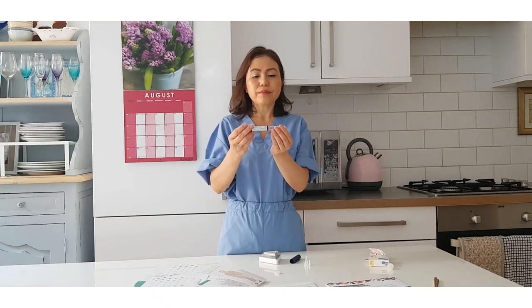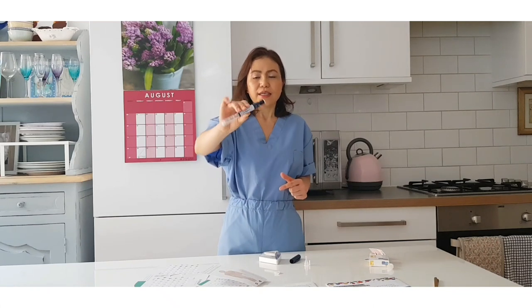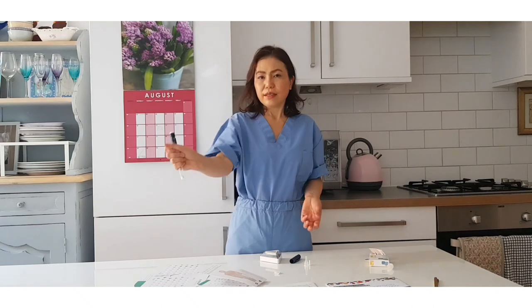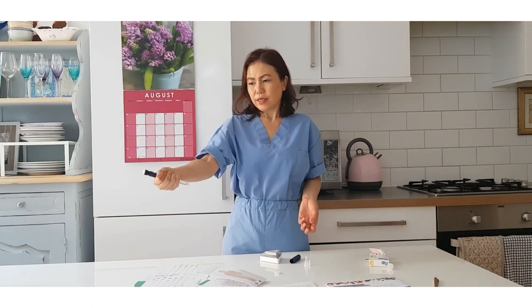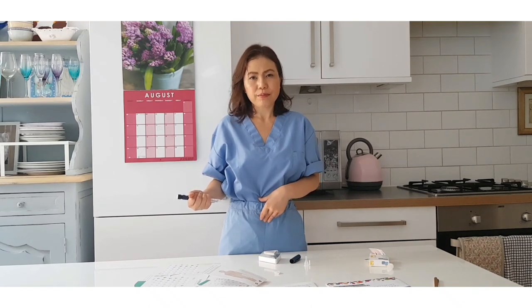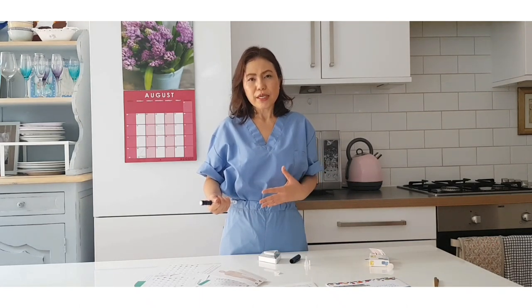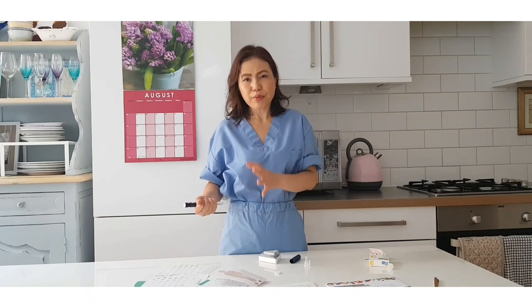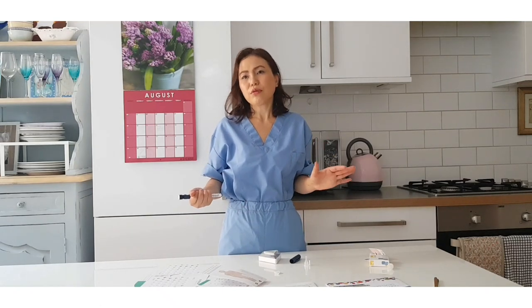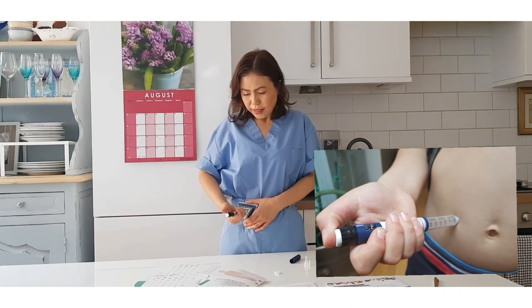If your diabetes practitioner has instructed you to start, say, 10 units, you dial 10 units - about 10 clicks. Then hold the pen at 90 degrees, like you're going to punch somebody - straight in at 90 degrees. The abdomen is quite good for quick-acting insulin - this could be NovoRapid, Apidra, or Humalog - for after meals. Obviously you want your insulin to bring down your blood sugar after eating, so when your meal is ready on the table, or about 10 to 15 minutes before, you can inject like this - 90 degrees in.